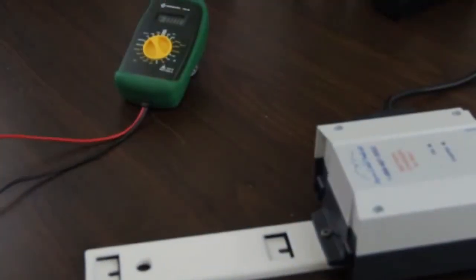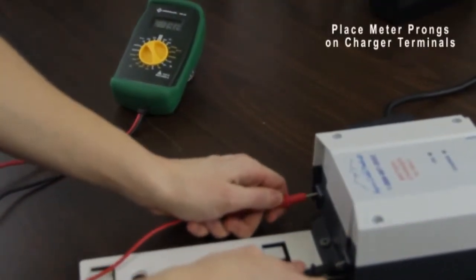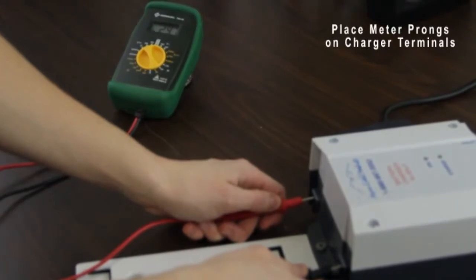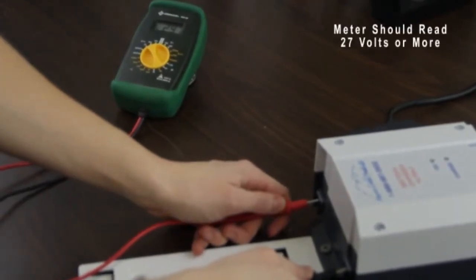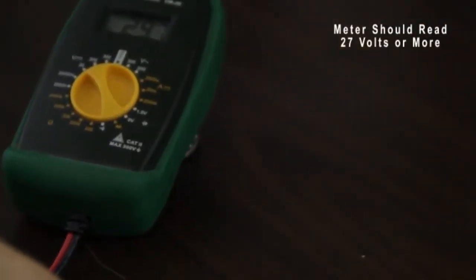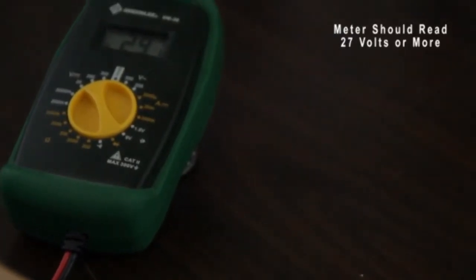Start by checking the voltage on your battery and charger. To check the charger, make sure the charger is plugged in. Using your voltmeter, place the prongs on the charger terminals. A good charger will read around 27 volts or more. If your charger reads below 27 volts, it needs to be replaced.